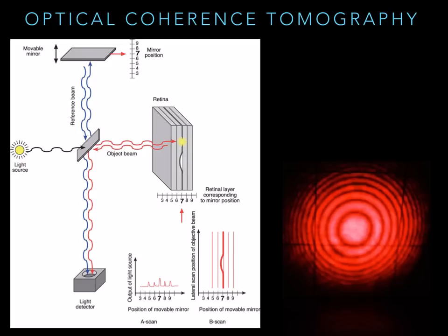If it's a half wavelength thick, it reflects it back, or a quarter, it reflects it back at a half, and then that cancels out the reflections. Does that ring a bell?